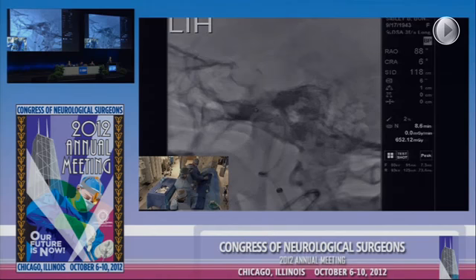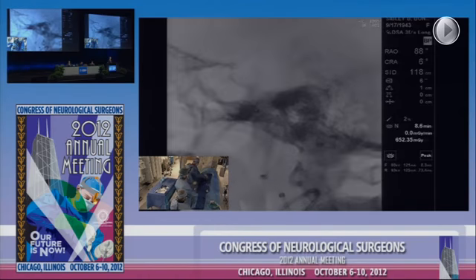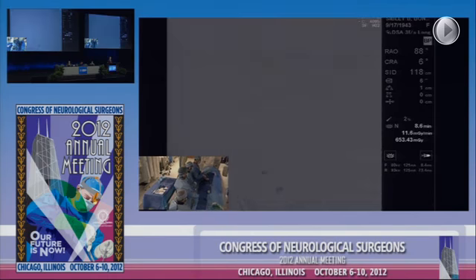Roadmap, please. Yep. Hold nice and still. Hold nice and still. Nice and still now, hon.